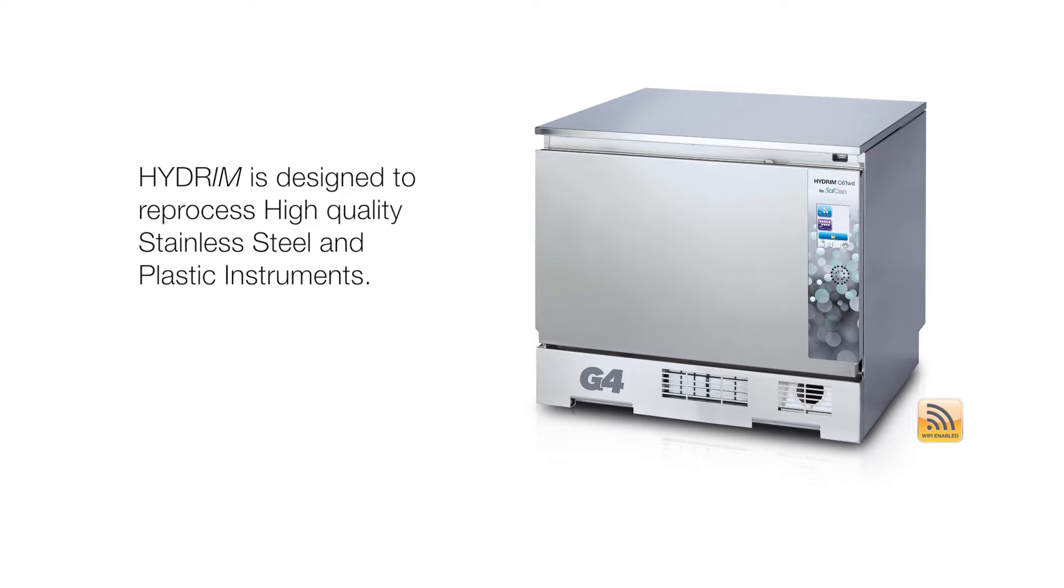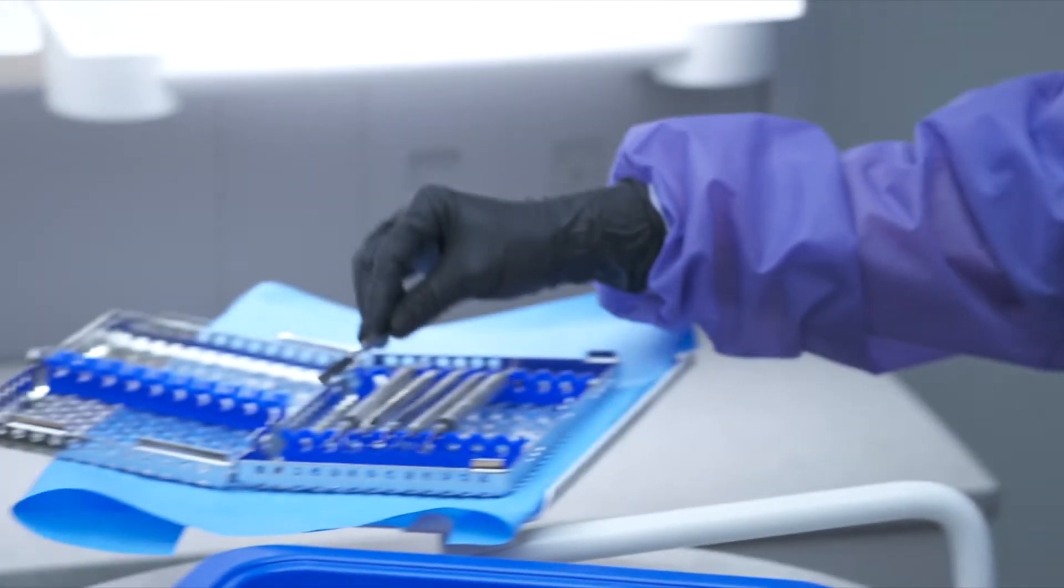Not all instruments and cassettes are compatible with a Hydrum. Do not reprocess dissimilar metals such as ultrasonic inserts, carbide burrs, and aluminum anodized or chrome plated instruments.